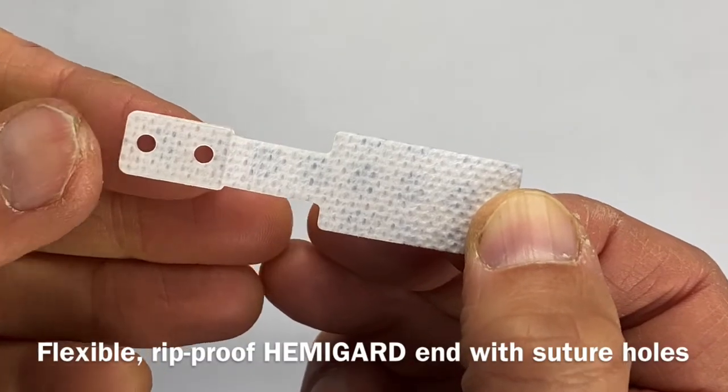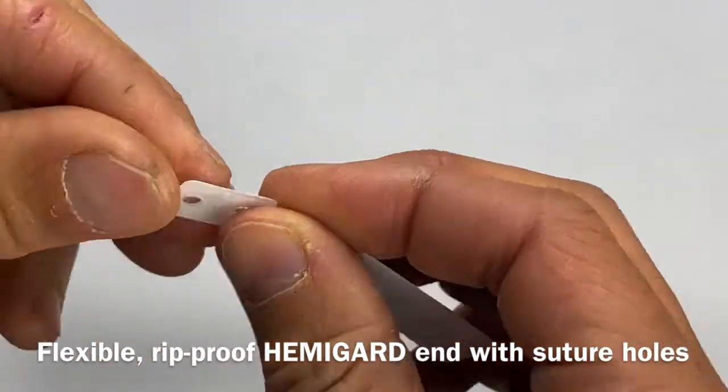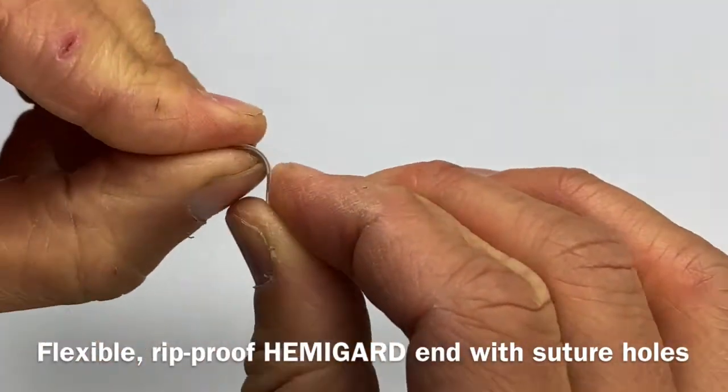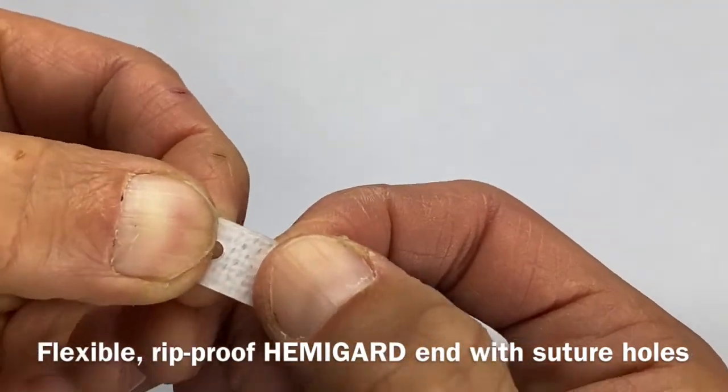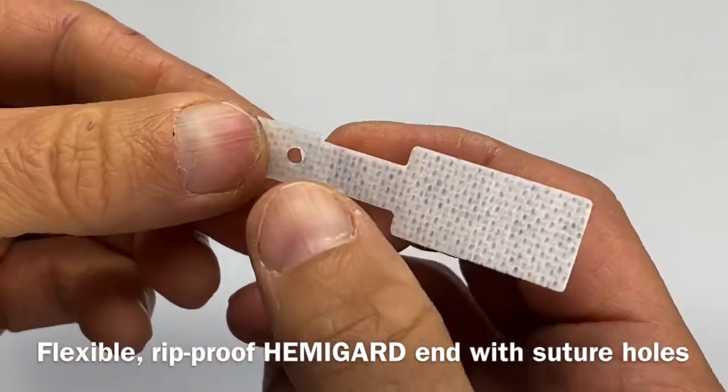Hi, this is Bill Lear of SutureGuard Medical with our new HemiGuard Adhesive Retention Suture Device. It has an end that faces the wound with holes that is flexible but rip-proof in order to prevent tearing with a high-tension nylon suture.